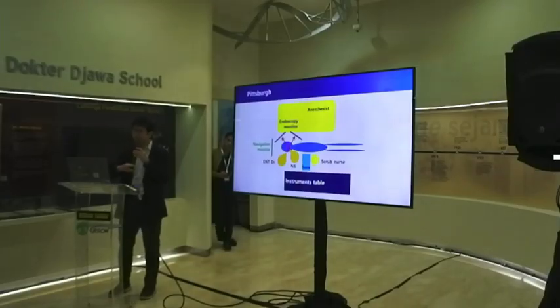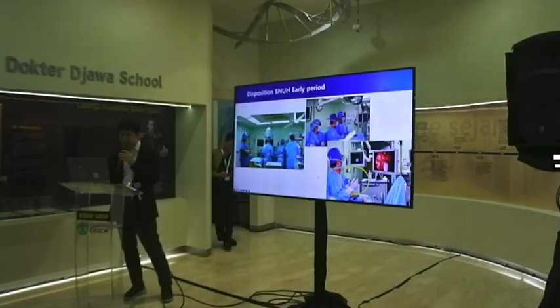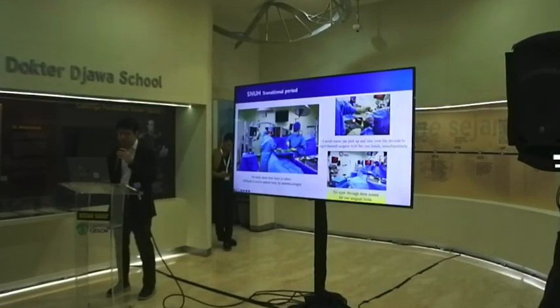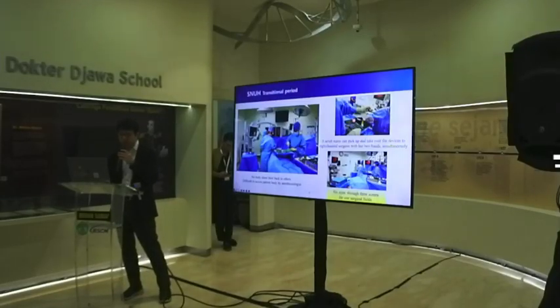So in the real field at Seoul National University, we have modified the setup. This is the surgical setup at Seoul National University from Professor Kim in the early period. At that time, it was linear like Pittsburgh.